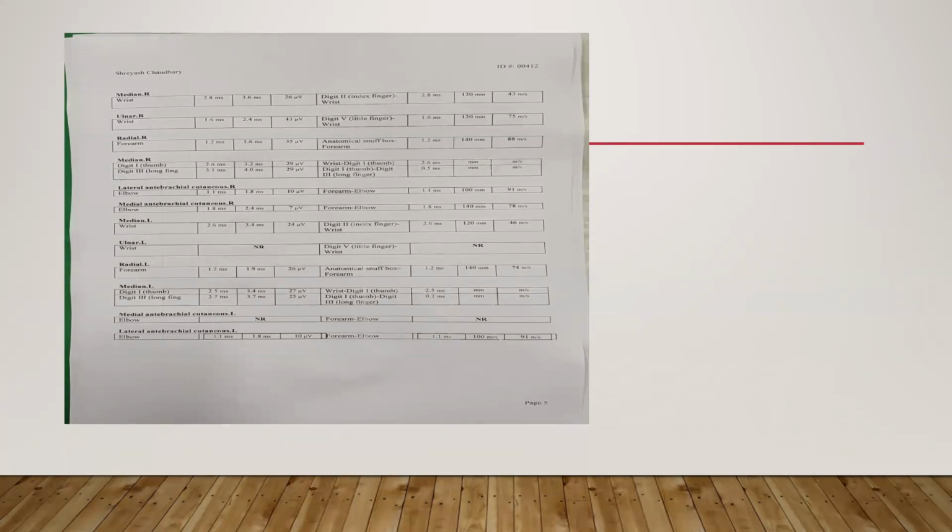So the possibility could be, madam, ulnar neuropathy or medial cord neuropathy. Ulnar neuropathy is there. But why ulnar neuropathy? LABC will be normal in ulnar neuropathy. MABC is the only thing that is spared, na, in ulnar neuropathy. So I mean, medial cord, madam, or root.